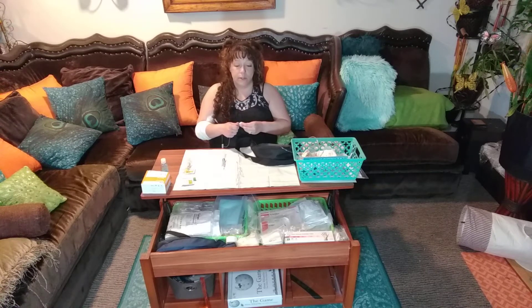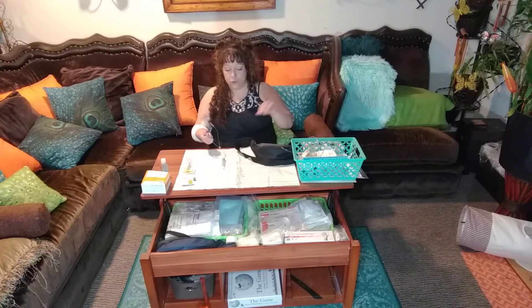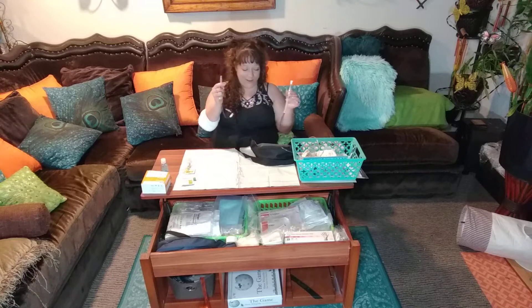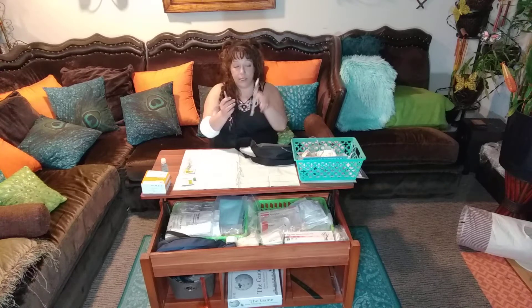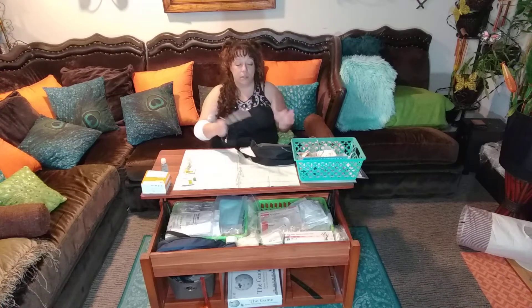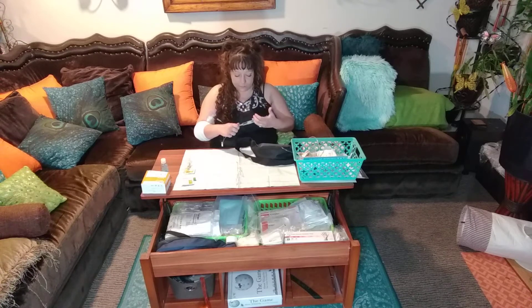I also want to let you guys see what's going on so you can see how successful the treatments are, what the treatment options are, and all that. So I'm ready to put the saline in. I've cleaned everything, and I've got this all ready to go. Remember I prepped it by putting the air out of the line. No touchy-touchy on the tip. And if you see a piece of hair or a particle or a bug touch your line, clean it again — you cannot emphasize that enough.